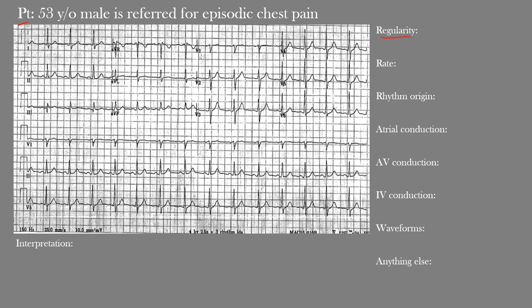The first step is regularity. On first impression, this EKG appears quite regular — this is a regular rhythm. How do we know? We look at the R-to-R intervals. Using calipers or measuring them out, you'd see these intervals are all the same length or duration. Consistent R-to-R intervals throughout — that's what we mean by a regular rhythm.